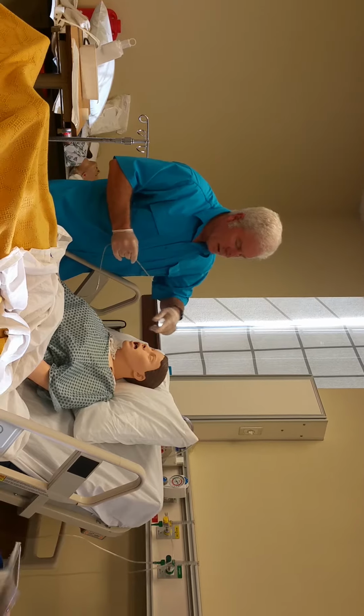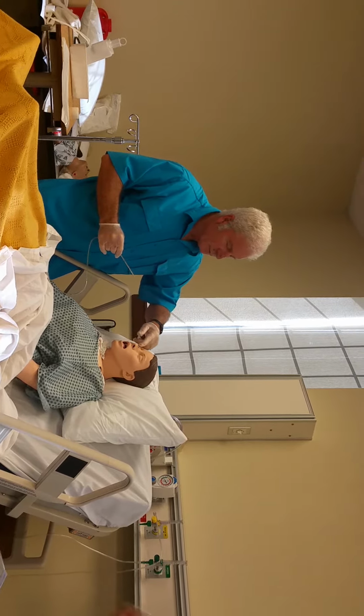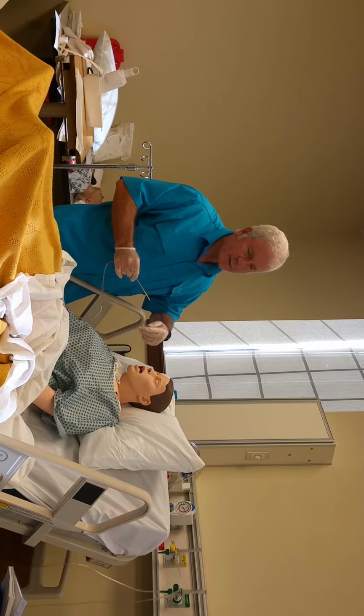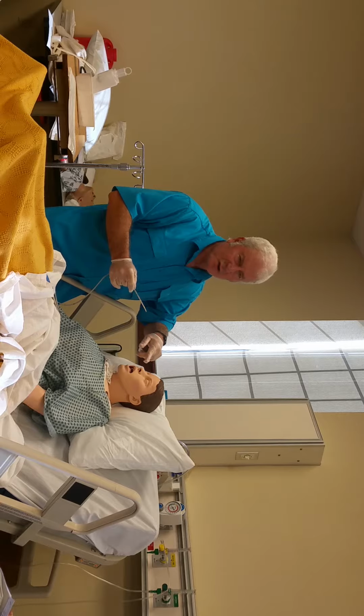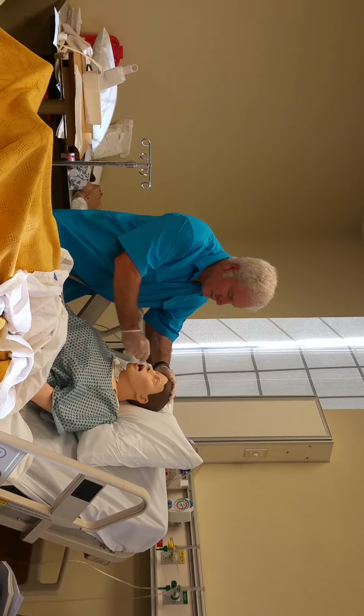So, the one thing you always want to ask that I didn't do yesterday, is there one side of your nose that you can breathe out of better than the other? Yeah, my left side's kind of stuffed up, okay? If his left side's stuffed up, we're gonna go into the right side. I'll just say, okay, he's breathing better out of this, it's more clear, so this is the side we're gonna go with. So I'm gonna push it in.